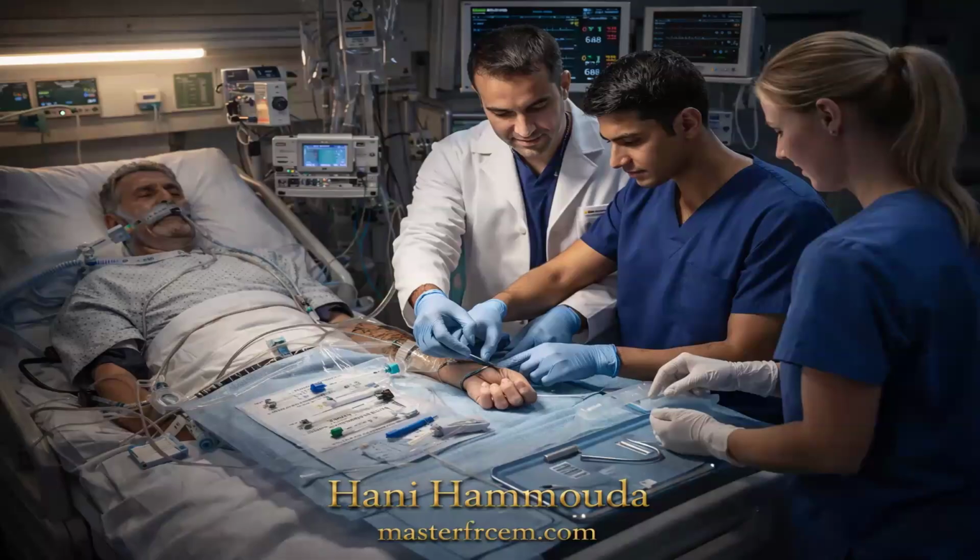Moving on to the complications. Of course, one of the commonest complications of arterial cannulation is bleeding, injury to the vessel itself and the surrounding vein as well, injury to the surrounding tissue. And then when we talk about how to avoid this complication, if you know your landmark, it will limit the complication. Alternatively, we can use ultrasound to avoid this.